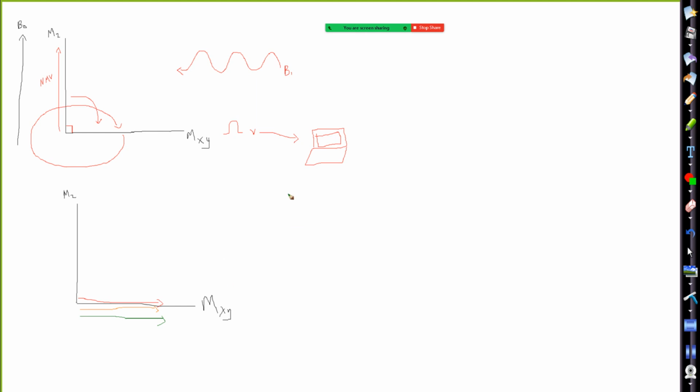So what we do is we turn off this RF pulse, and these vectors slowly decay, or quickly decay actually, and then they recover along this longitudinal plane, okay? Because remember, this is where they're ultimately the happiest, where they return to their lowest energy state. But what's cool about all these different tissues, based on just their molecular structure, is they relax or decay and recover at different times. And they're all usually in the range of milliseconds, but they decay and recover at different times.